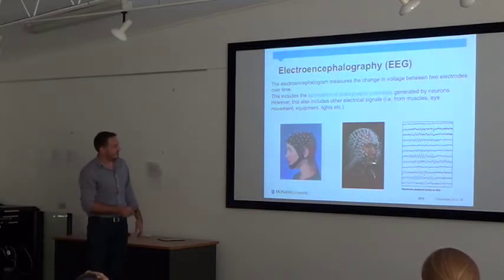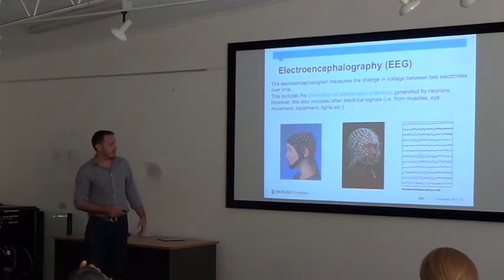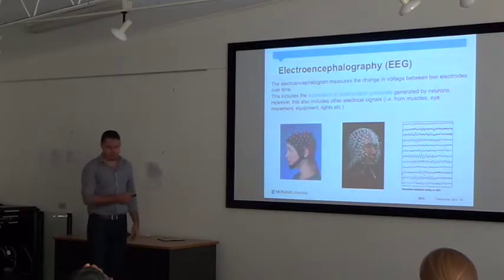And here's just a couple of examples. I particularly like this really high density one. This was from some kind of a meditation study. And this is essentially what you get when you look at the EEG signal. You get all these lovely squiggly lines.